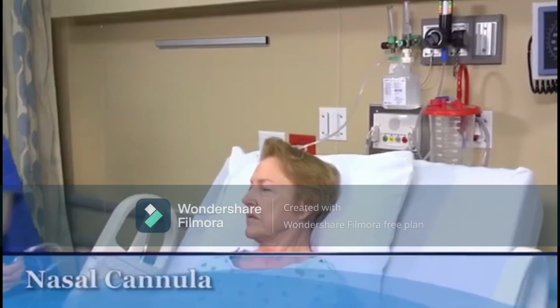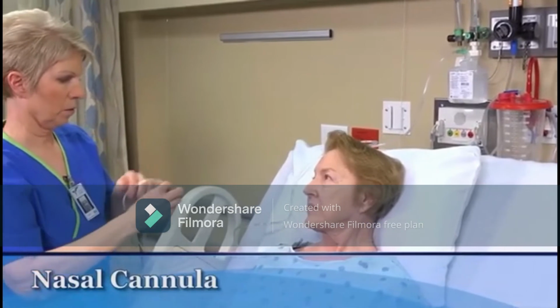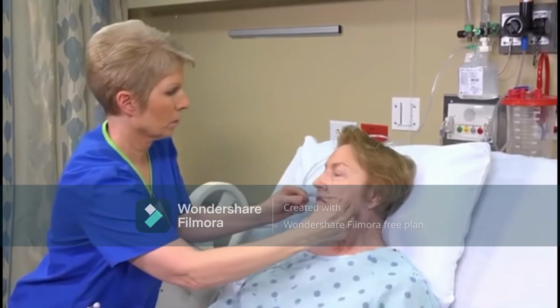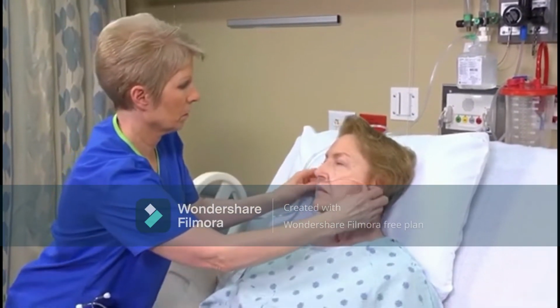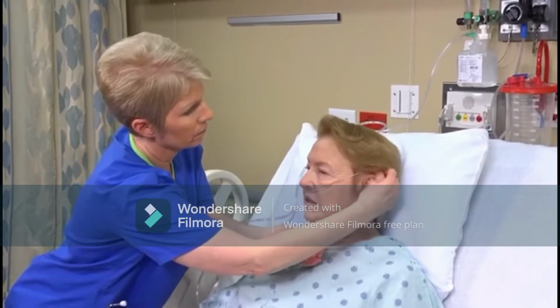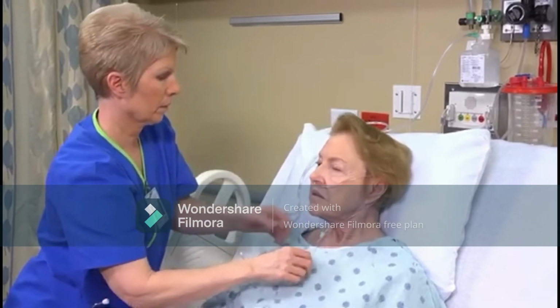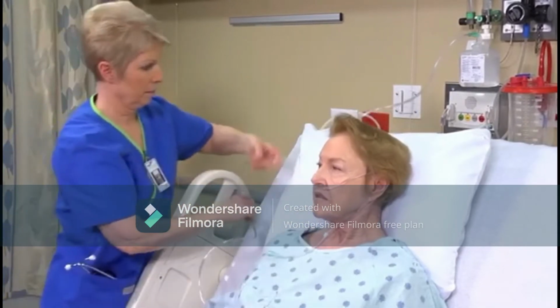To position a nasal cannula, place the tips in the patient's nares and adjust the elastic headband or plastic slide so that it fits comfortably and snugly. Leave some slack on the oxygen tubing to keep it from pulling out as the patient moves. Secure the tubing to the patient's gown if necessary.